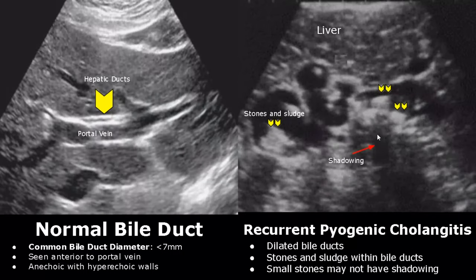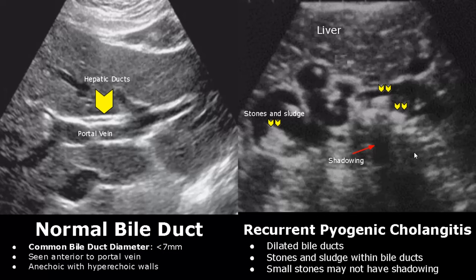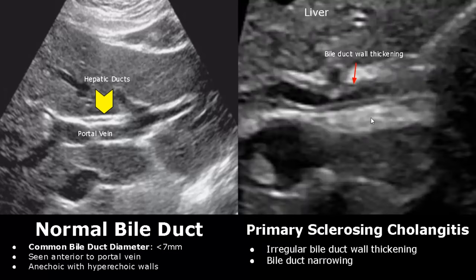Recurrent pyogenic cholangitis is a disease in which there are dilated bile ducts filled with stones and sludge. The stones will often have shadowing, but smaller stones may not. It occurs in the setting of a bacterial biliary tract infection. In primary sclerosing cholangitis, there is irregular bile duct wall thickening and narrowing of the bile duct lumen — at certain points there is more wall thickening compared to adjacent areas, making it irregular.